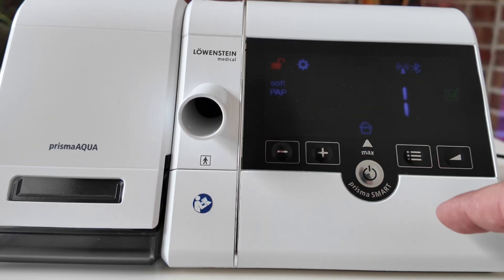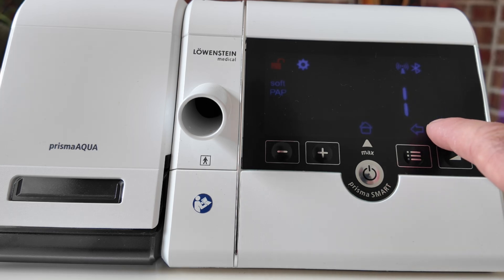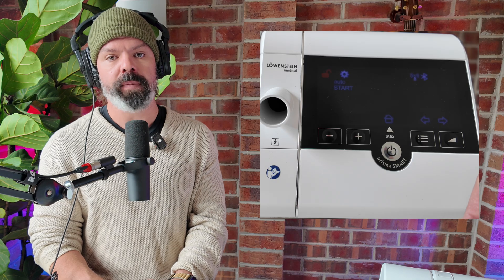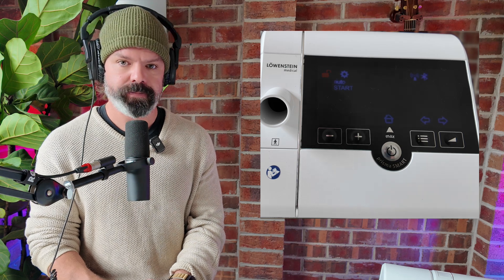You'll now see a flashing padlock icon on the screen. This feature allows clinicians to lock the setting so patients can't accidentally change it. We'll keep the padlock unlocked for now. Next up is auto start — when this feature is turned on, the device will automatically detect when you're wearing your mask and it will start the airflow, with no need to press any buttons. And it will automatically stop therapy when you remove the mask. We'll leave that toggled on.